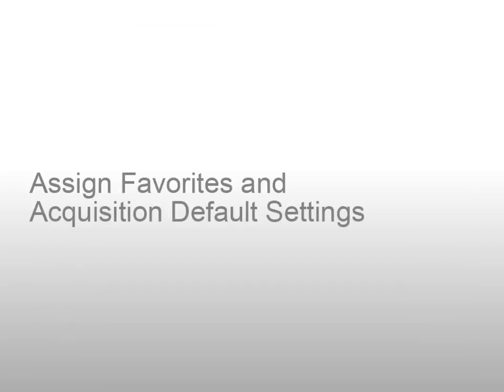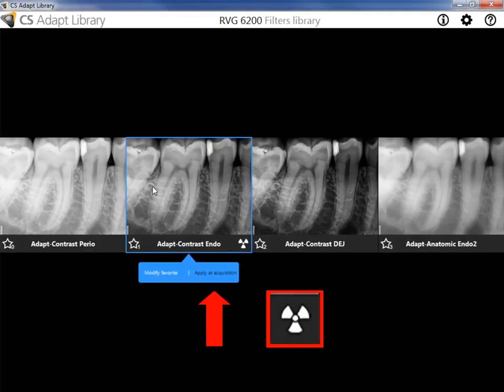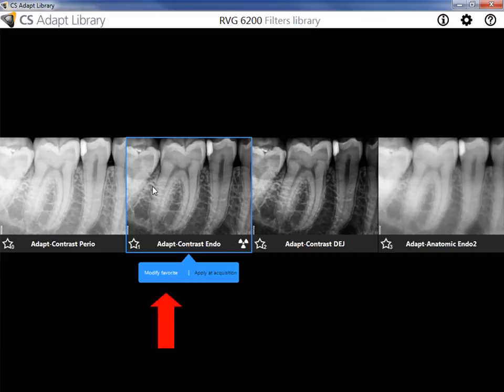Assign Favorites and Acquisition Default Settings. When the CS ADAPT Filter Library is opened, you can assign a favorite to its corresponding button and select a favorite to be applied at acquisition. The filter selected to apply at acquisition is identified by the X-ray symbol. Click Modify Favorite to select filters displayed by each control panel button.